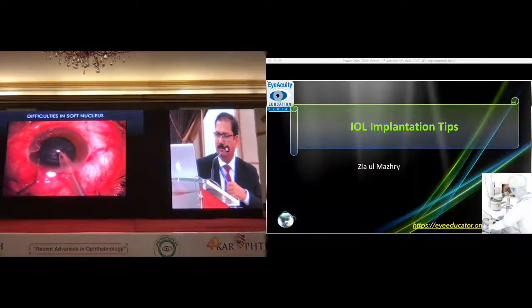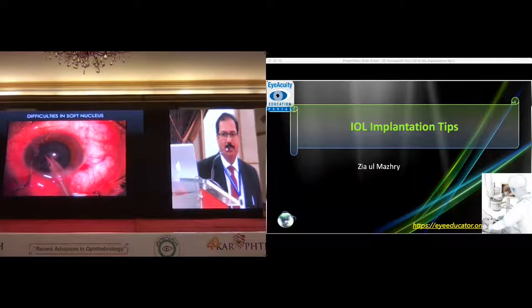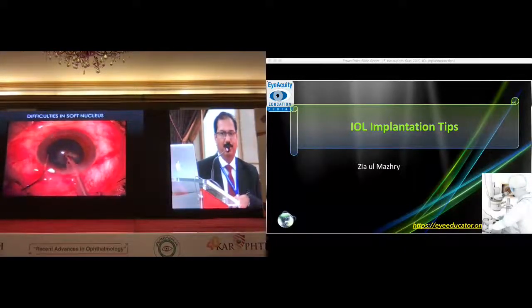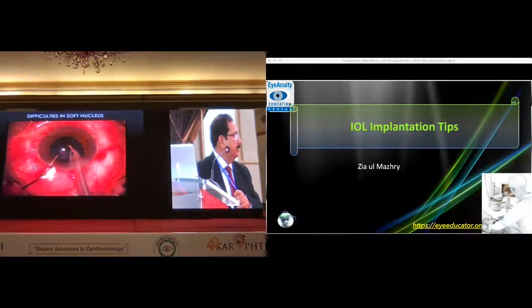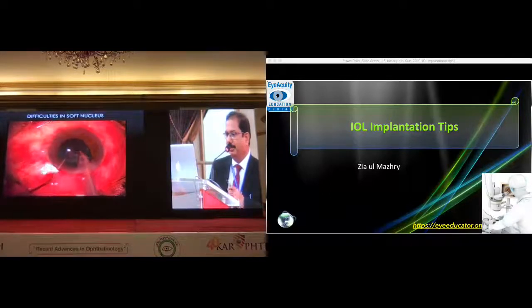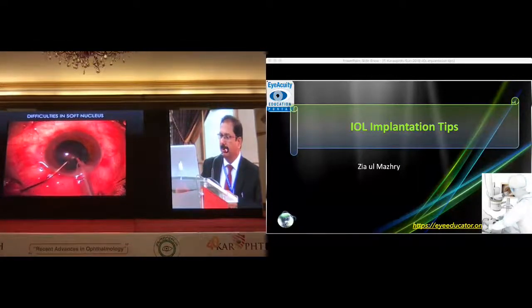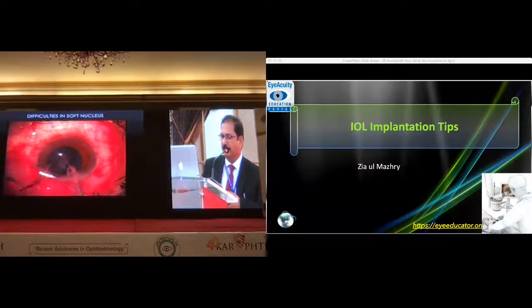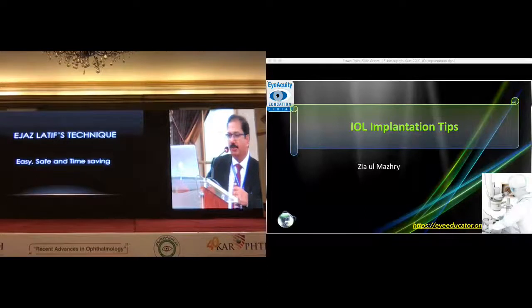It's not very soft, but it's soft. It's not hard. It's not diffusive. It's very difficult to maneuver it, especially in the second half. I'm going to share the technique I'm using for the soft nucleus nowadays. I've done more than 400 cases and I found it a very effective and very safe technique for such nuclei.